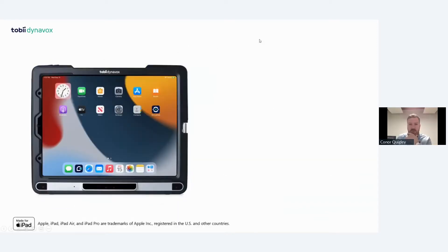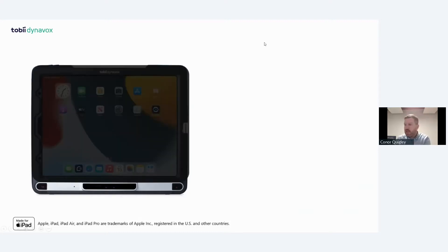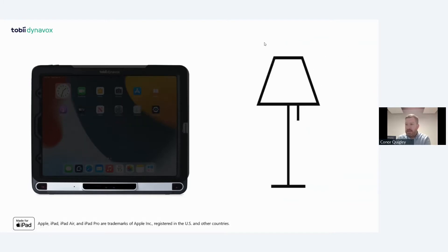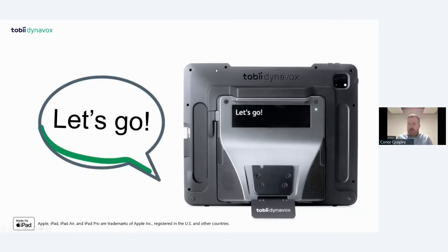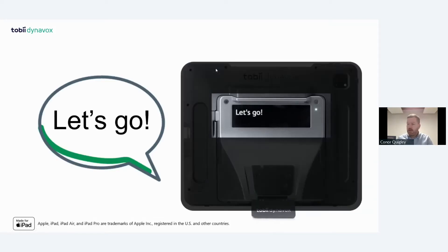Similar to some of our other eye gaze devices, the TD Pilot can be used in different scenarios — whether that's in the shade outdoors, indoors, or different lighting scenarios. The ability to use it outdoors is a new feature that also transfers to the eye tracker built into the TD Pilot. It turns your iPad into a communication device, with a partner window at the back and loud speakers so you can be heard.